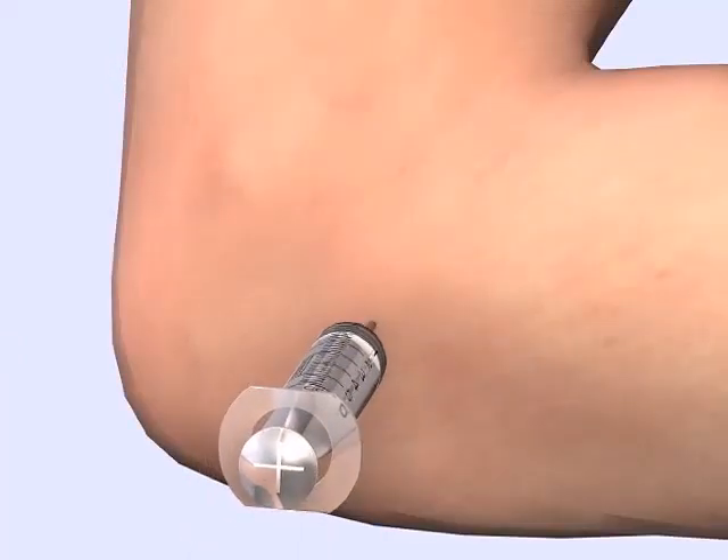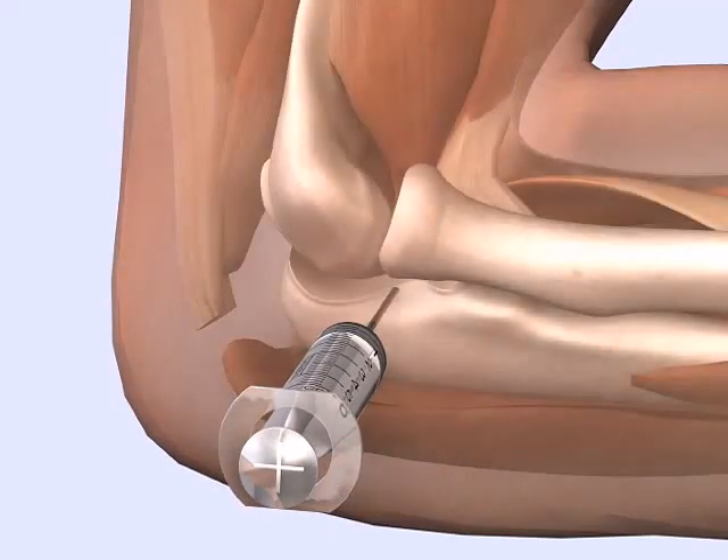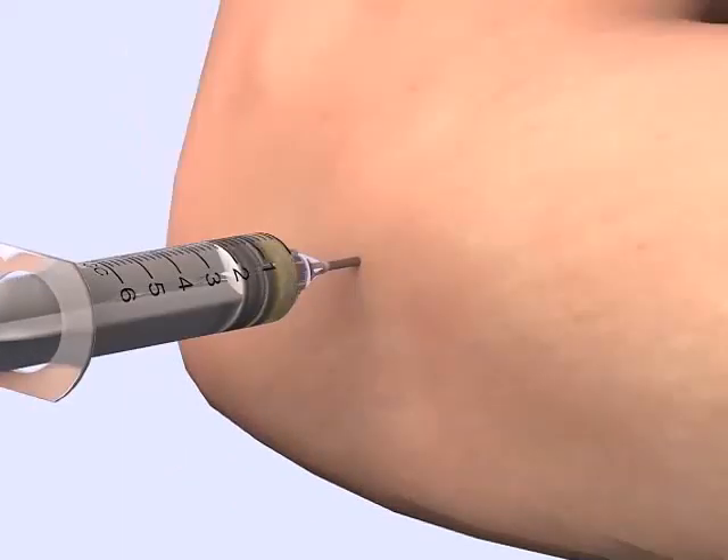Direct the needle medially toward the medial epicondyle. Pull back on the plunger as you advance. Synovial fluid will fill the syringe when the joint is entered.